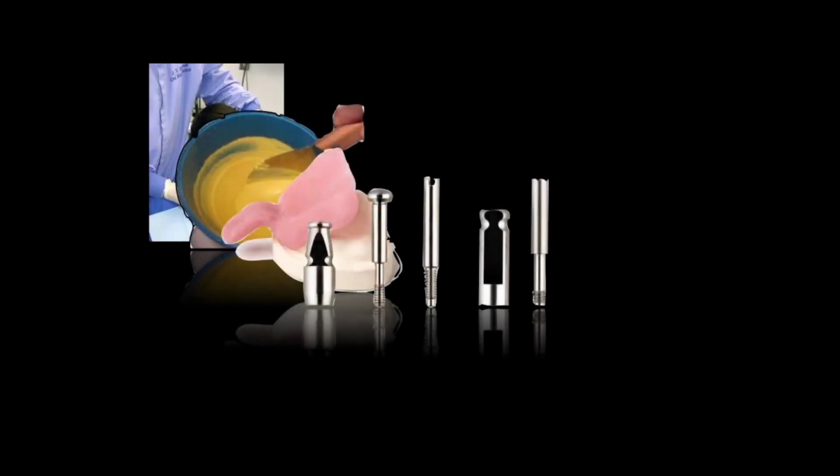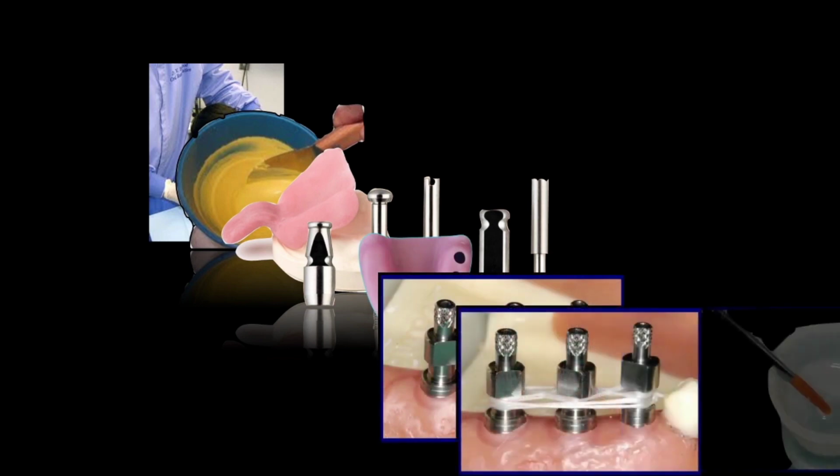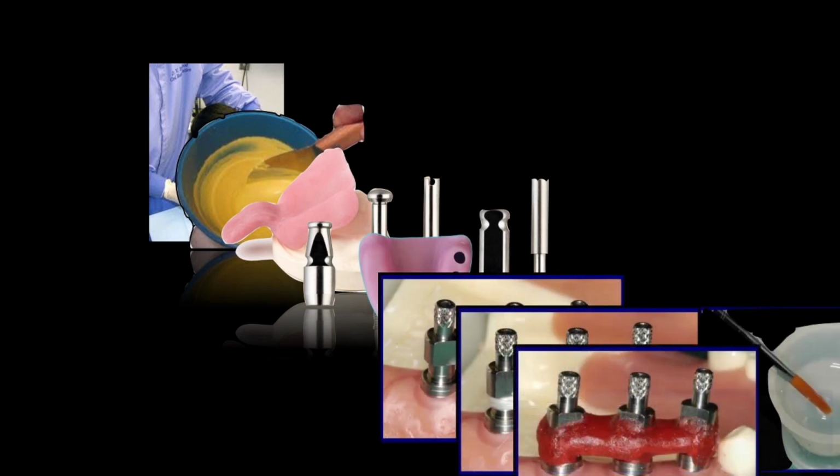First off, you need an intraoral scanner to do this digital restoration, all right? Now let's look at how this works. Let's compare it to the analog process. This here is the file that I used to use when I lectured on the analog impression taking process long ago. It's complicated and hard to explain in words.